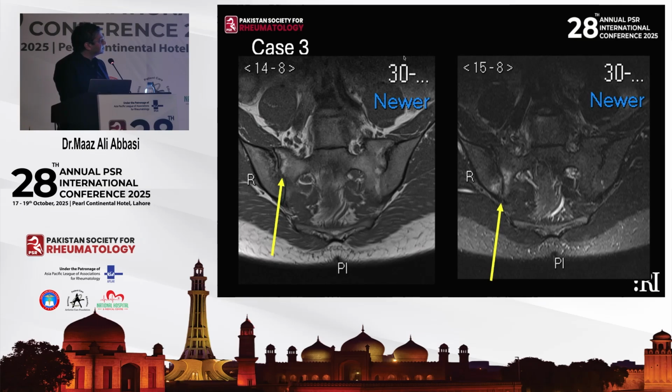this is fatty metaplasia, and it's in a periarticular distribution, and the cortical margins are irregular here, so these are erosions. So this is chronic sacroiliitis. So if you said either, you were correct, but the right answer was this is active on chronic sacroiliitis, i.e. you've got chronic sacroiliitis and now you've got active inflammation, okay? So that's what we're looking for.